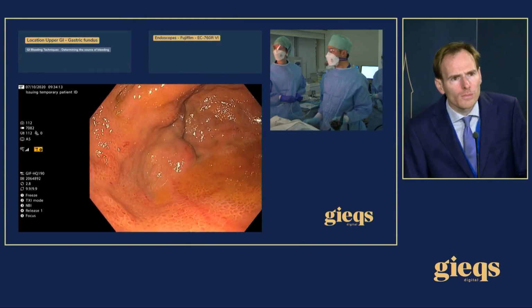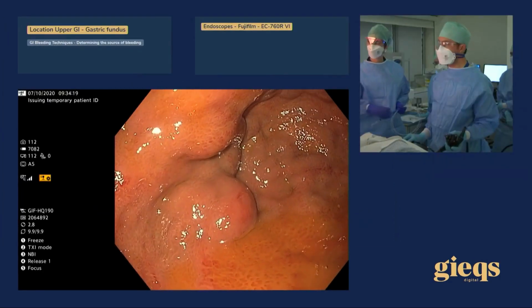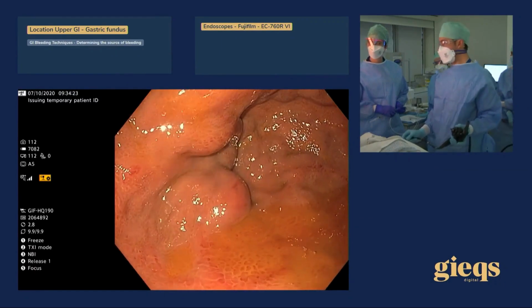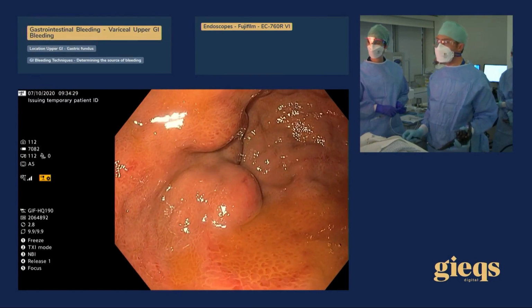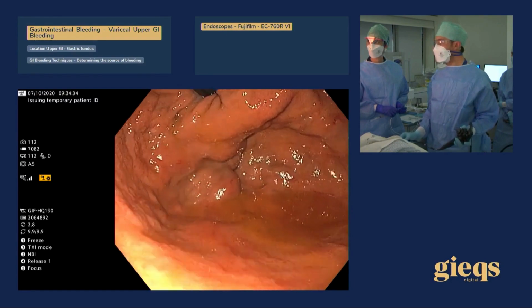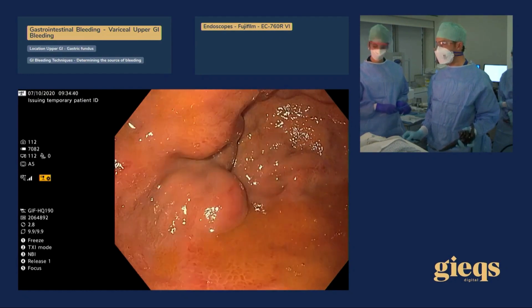There's also, I can't see it very well from here. Is there a kind of a red dot on the varix? Yes, indeed. And so actually that's a good point. We also did this procedure a few days ago when we weren't certain we were going to treat this because we were trying to work the patient up. There was no blood in the stomach at the time, and it was bigger then, and there was a red spot on it. But the patient has continued to have melena in the interim, and so we can only assume that this is the responsible lesion.